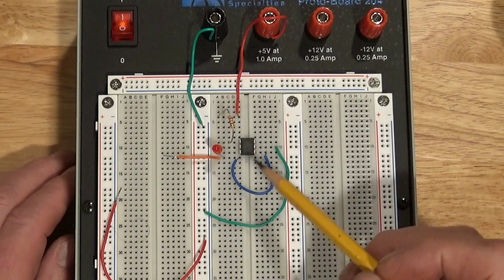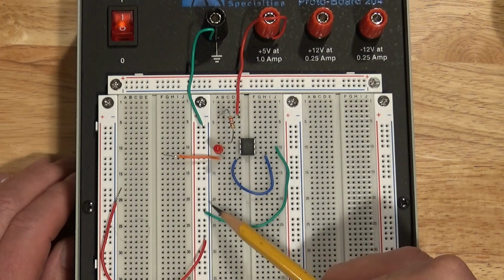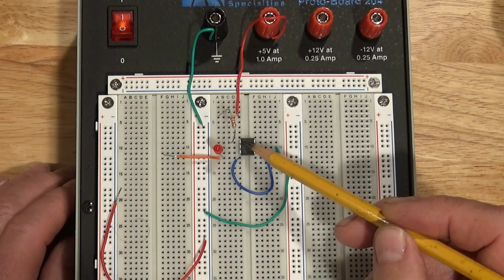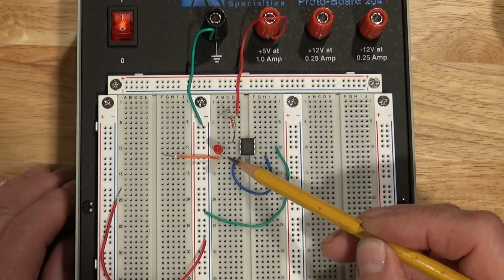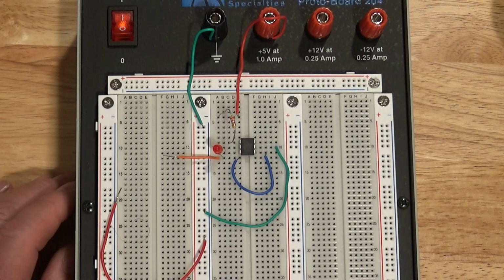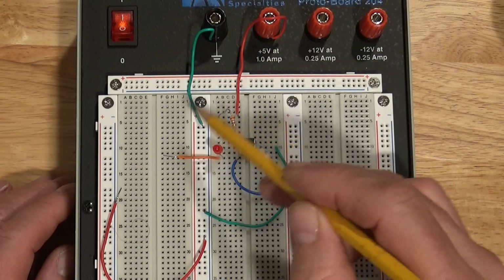And so in this case, I'm using it to latch on when I get a conductive path between the electrode tip and the probe. And so I've got 5 volts coming in through a 220 ohm current limiting resistor, and it goes through the anode to the cathode internally, and then externally there's an anode to cathode on the LED. And this wire here represents a connection on the Omnetics connector. That would be the 16 recording electrode pins, and then there's actually 2 ground pins, so I'm checking those as well. So there's going to be 18 of these circuits.